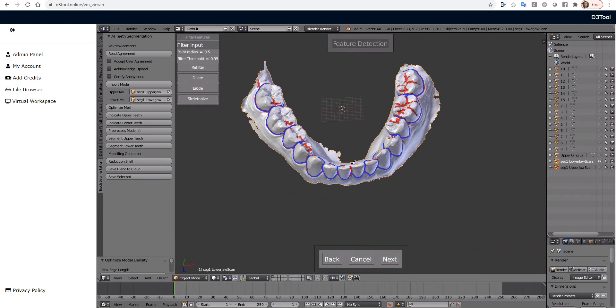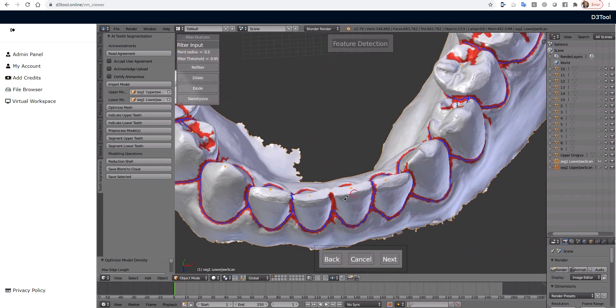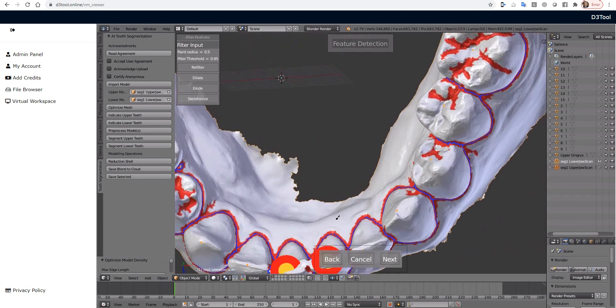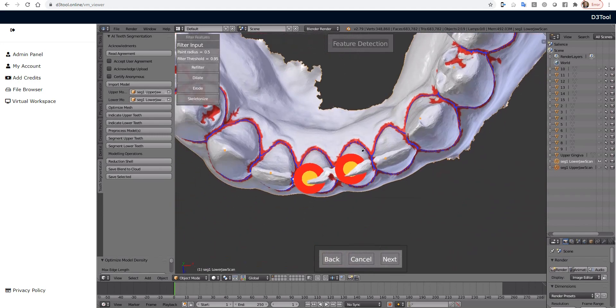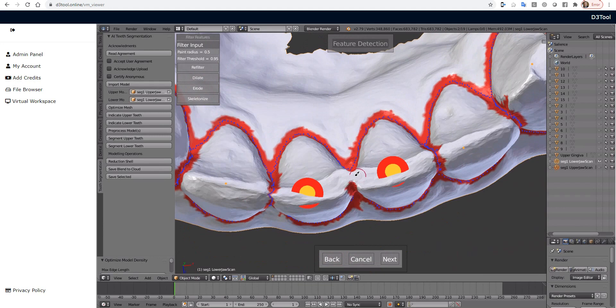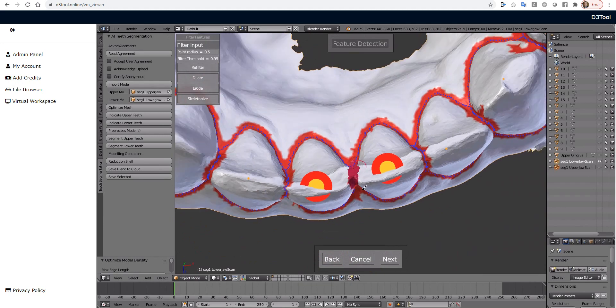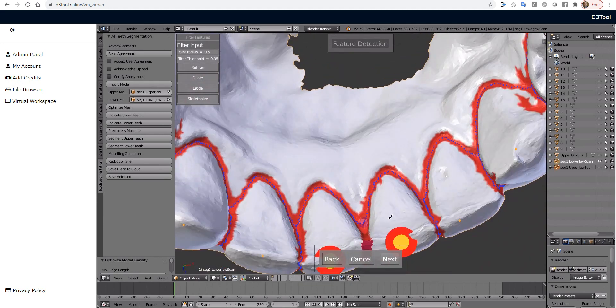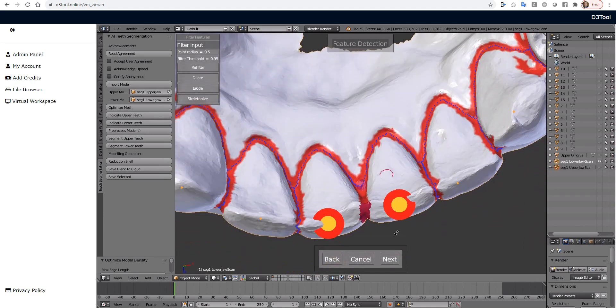Now there's an error right here where there's not really a nice groove across the incisal embrasure. So if I click Next and try to go to the next step, it's going to tell us, oh, you're missing, those two teeth don't have individual patches. So I'm going to paint right across there. Perfect. And hit Next again.